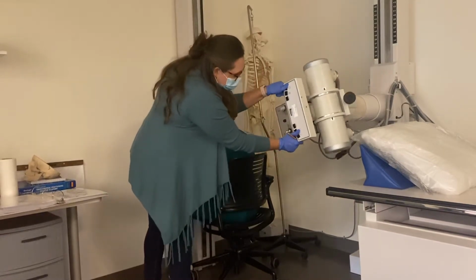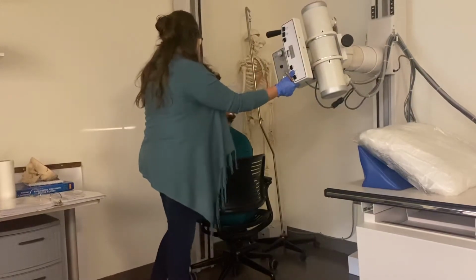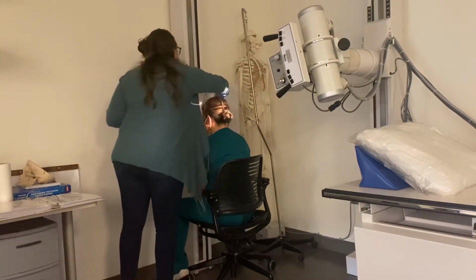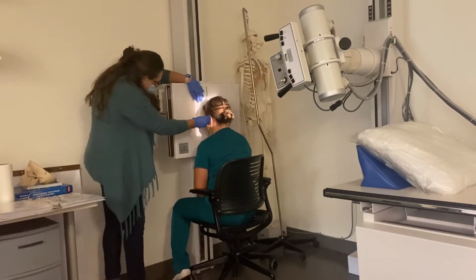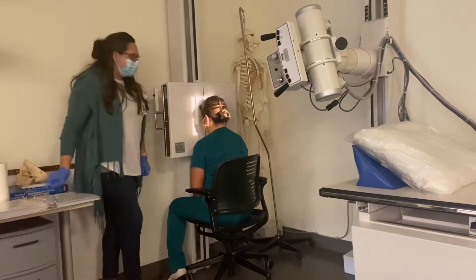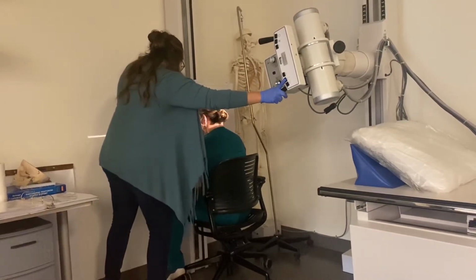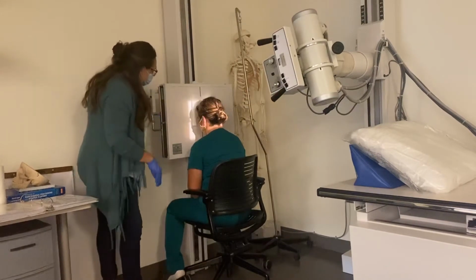So I usually start with the PA, and the PA Caldwell, I'm gonna angle my tube down 15 degrees caudal. Again, we're gonna stay at that 8x10 collimation size. I'm gonna put my marker on the correct side. I'm gonna make sure that my OML is perpendicular to the IR, which looks good right there. And I'm going to exit at the nasion. If you can't see, just open up the light so you can use that line again. And then make sure to close it back down for collimation. And that's all lined up there.